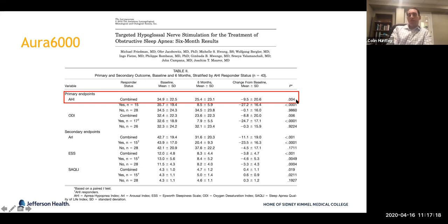This was statistically significant. Not sure if this is clinically significant, but this was the first trial. So anytime any of these products come out, there's always work to be done to optimize, and that's what this company is working toward now.